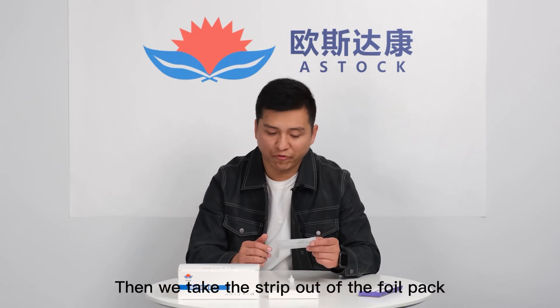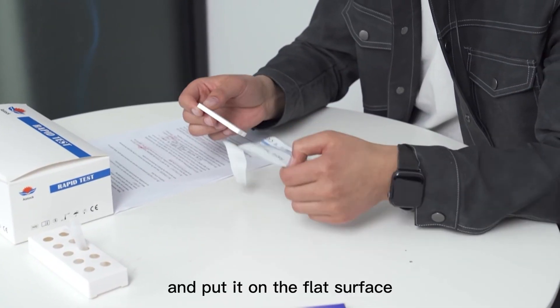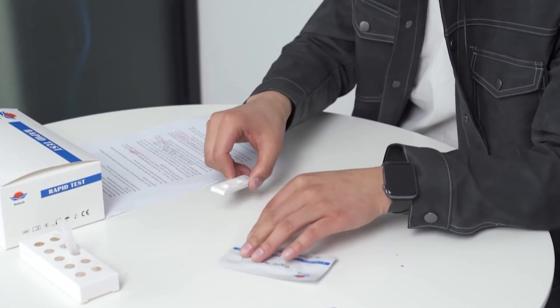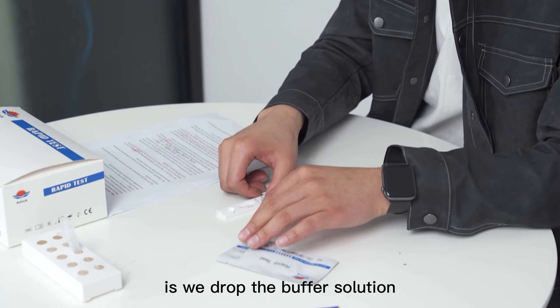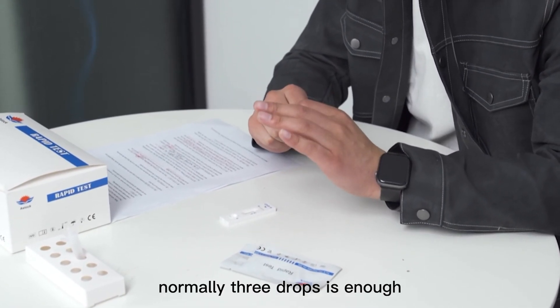Then take the test strip out of the foil pack and place it on a flat surface. What we need to do now is drop the buffer solution into the hole — normally three drops is enough.